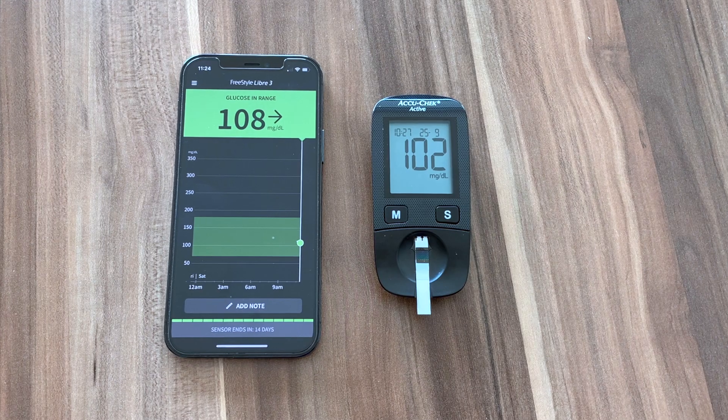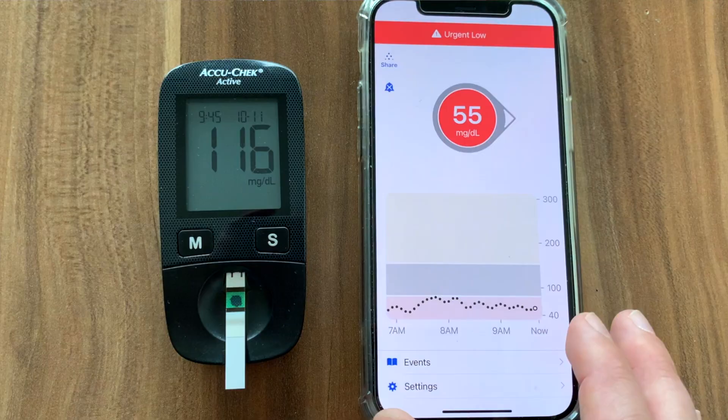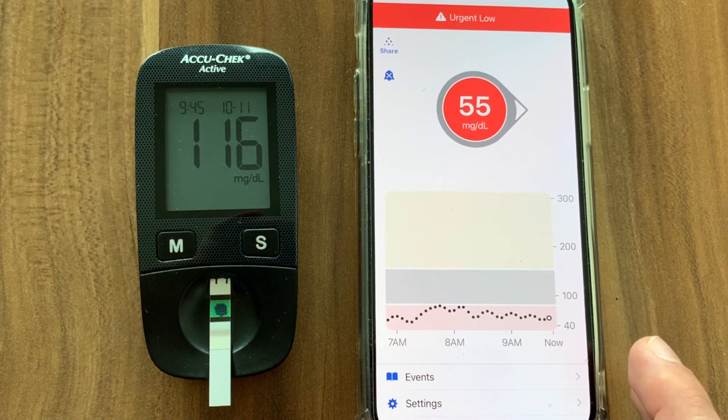As an effect, Freestyle Libre 3 is more timely, which makes it seem more accurate as well. Overall both sensors feel quite accurate, but I have one complaint about each of them. Libre 3 readings tend to be a bit lower than those from a finger prick most of the time — this has been the issue with all previous generations for many Freestyle Libre users, and it still seems to be the case with Freestyle Libre 3. My readings haven't been off by a lot, but it's definitely something I need to take into account. The issue I've been having with Dexcom G6 is that it's been notoriously inaccurate on the first day — it's always off a lot during the first 6 to 8 hours, but on day 2 the accuracy magically improves.